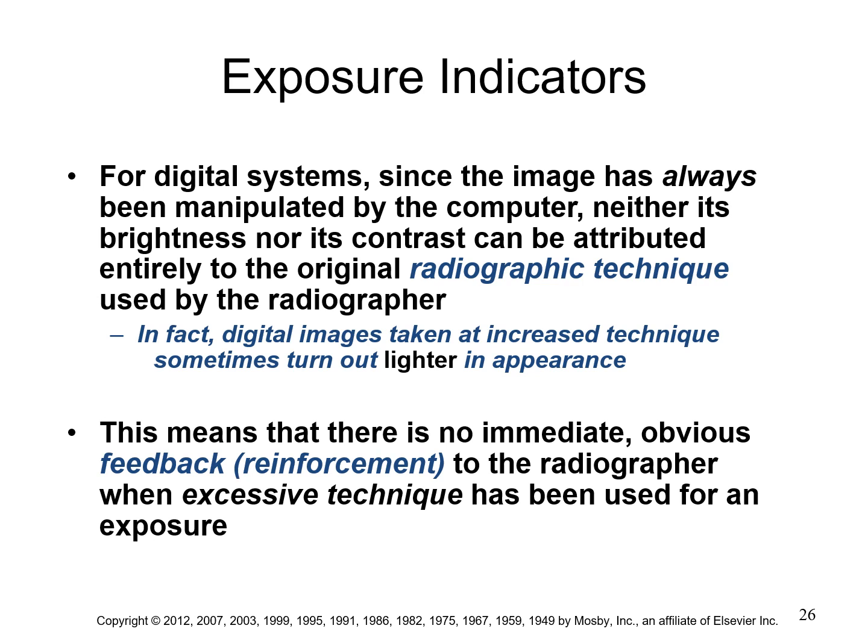Exposure indicators. So with digital technology, now we have a strength readout for your remnant beam. The manufacturer calls that the exposure indicator. The exposure indicator tells the technologist how much exposure was delivered to the image receptor on a number scale that tells you what the manufacturer considers optimal. For example, Kodak CR, the recommended number scale is 1800 to 2200. So an average of 2000 plus or minus 200.